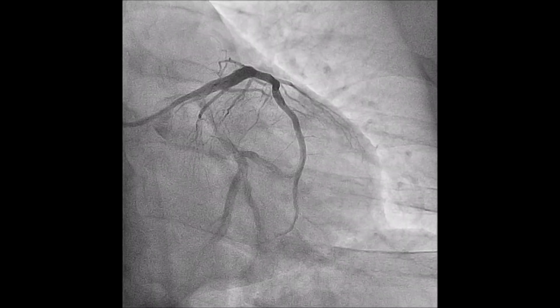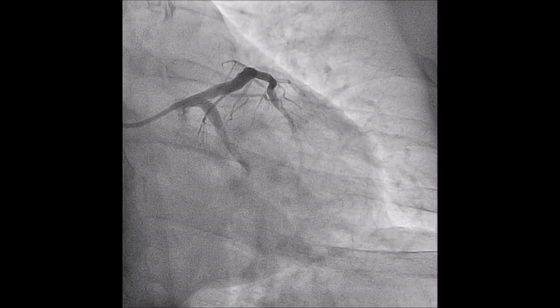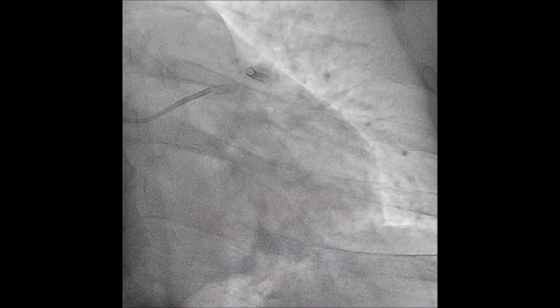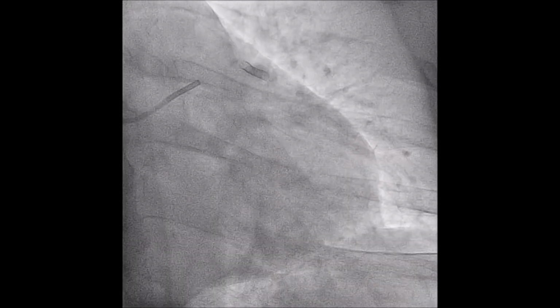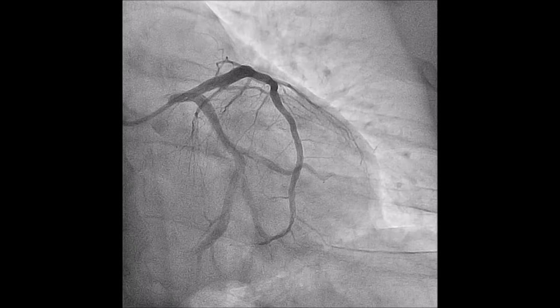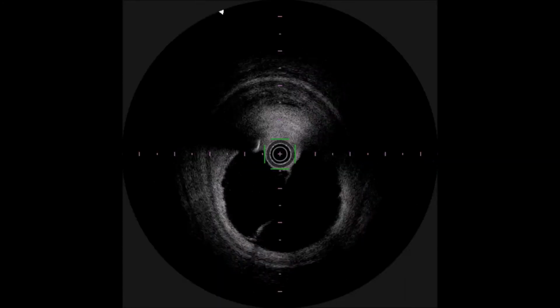After a couple of days and after an optimal antithrombotic treatment, the patient returned to the cath lab with the objective of studying the result obtained with an intracoronary image technique, in this case an OCT or optical coherence tomography. As you can see, this diagnostic tool allows us to see a superposition of axial cuts of the coronary vessel, allowing us to see the interior of the studied vascular segment from distal to proximal.